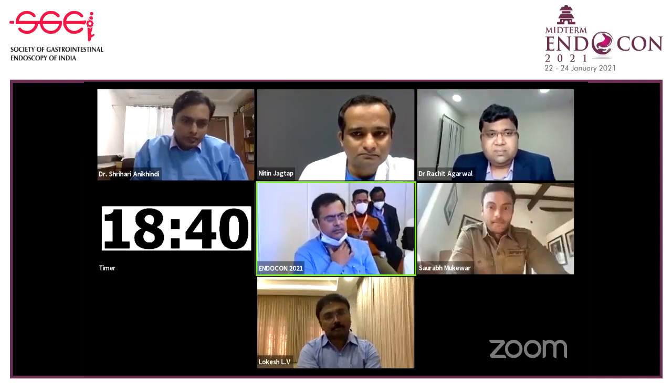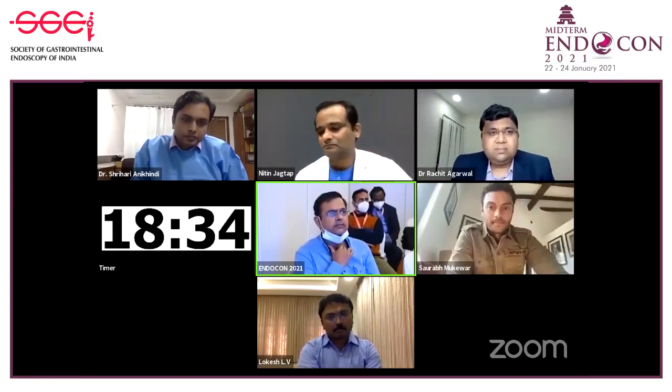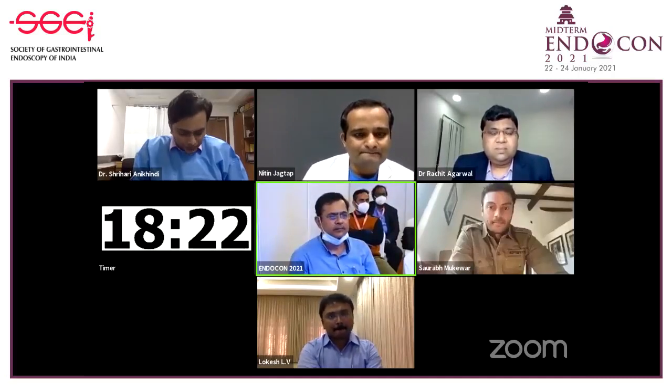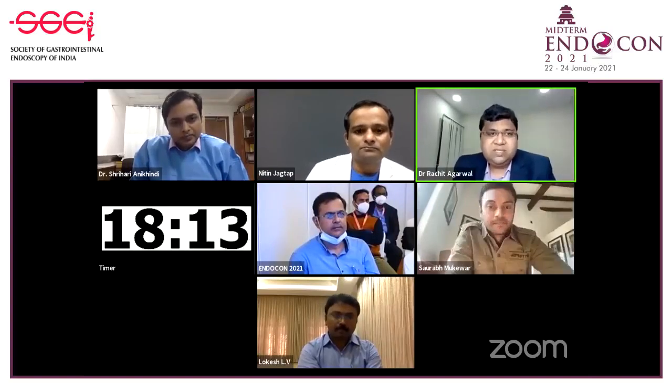Great. Thank you. And I think, as you see, in India, in busy centers if you can't give sedation, I think oftentimes I feel Barrett's is probably missed. And I think we need to underscore the importance of actually doing a very careful white light examination, especially to find these neoplastic lesions, which can be easily missed, right? Yes, you're absolutely right. The prevalence is apparently quite low in the Asia Pacific region. We don't know whether it's due to lack of actual surveillance or it's the actual data. So maybe spending much more time in an endoscopy suite would be better, and maybe you'll be able to pick up more lesions.